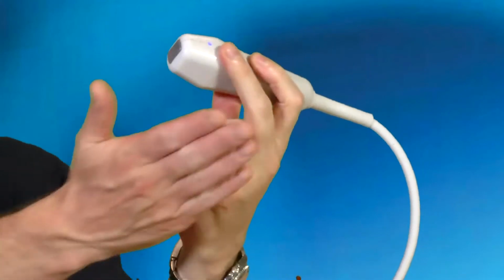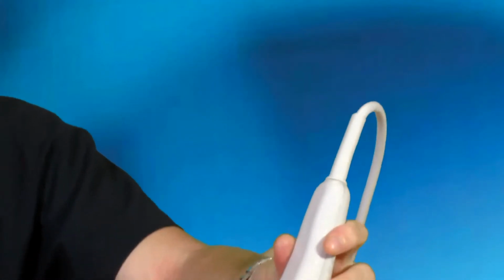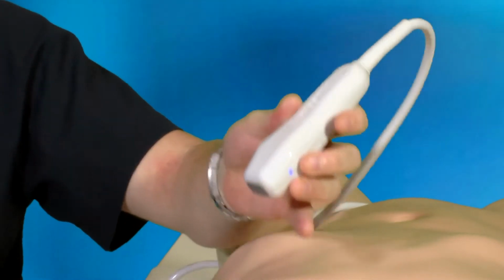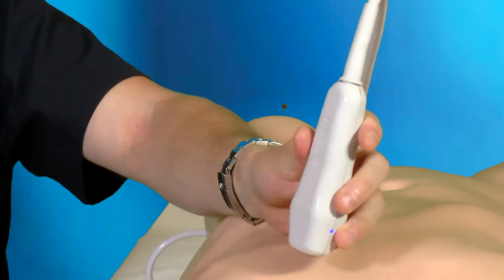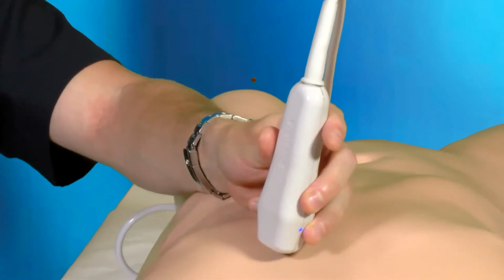I hold it almost like a pencil, and that's so that with the back of my hand, I can rest that on the patient. Because when you've got gel and things being used, it can be surprisingly easy for the probe to slide around. So I use the back of my hand as the anchoring point, and then I can put my probe on the patient, and I don't move around too much.